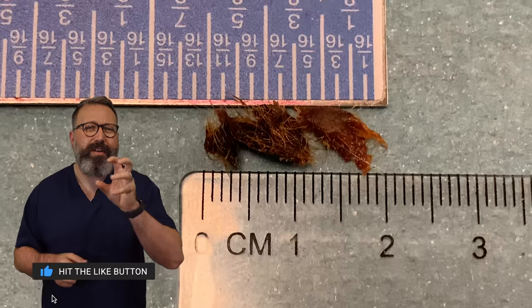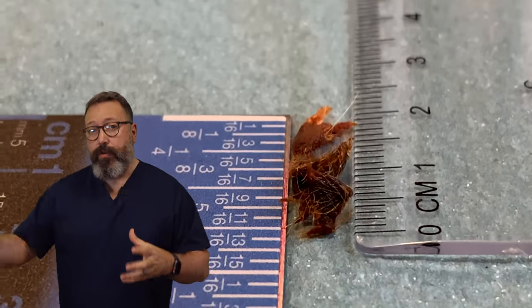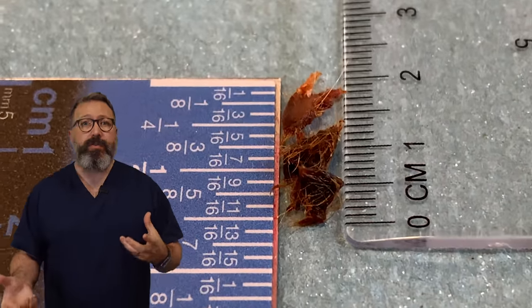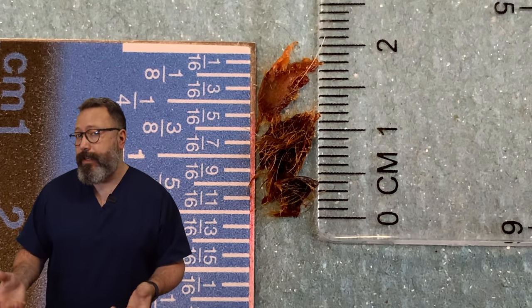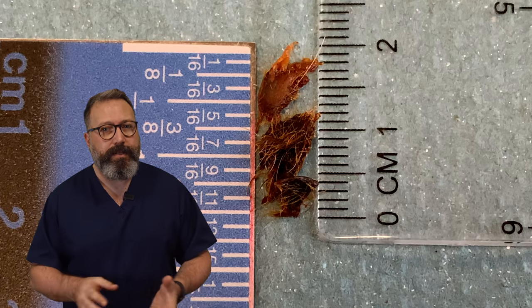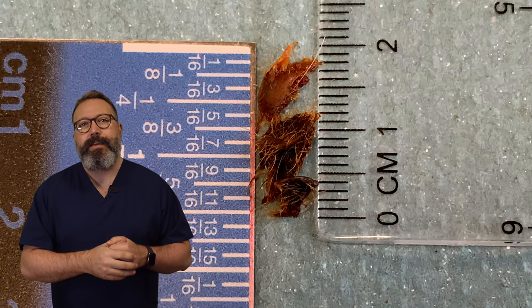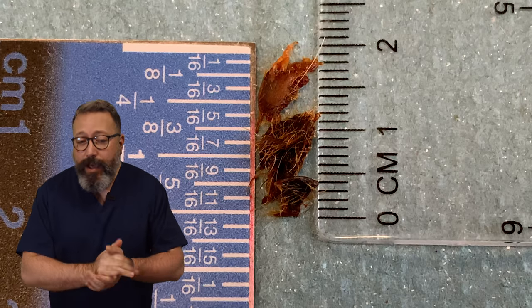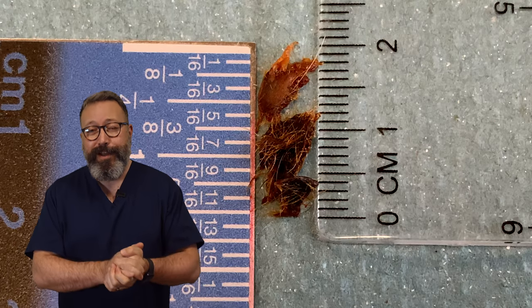Lots of very quick ones. Now, when we do wax removal in clinics, sometimes you'll have a day where they're all like this, or you can have a day like I've had today where everything's just taken forever to do. We've had some big ones in today — I'm not going to spoil that, this one's coming up on Monday for you. So you can see that's the last bit to come away. Well guys, I hope you enjoyed that video as much as I did, even though I did get a bit lost as to how many patients we had in this video.